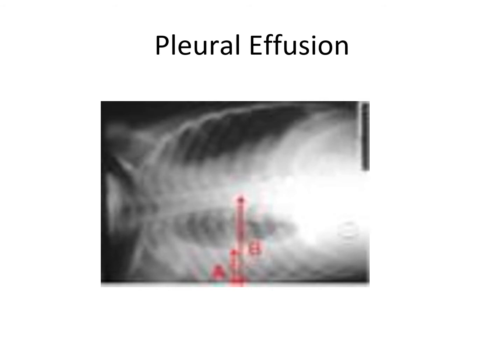Here's a picture of a pleural effusion. Sorry, it's a little bit blurry, but you can see the patient is laying on their left side there, and the area marked A is where the fluid is. The whole left lung is the B part, and you can see close to half of it, all that haziness, is the fluid, and the darker part would be the lung. So there's quite a bit of fluid there.